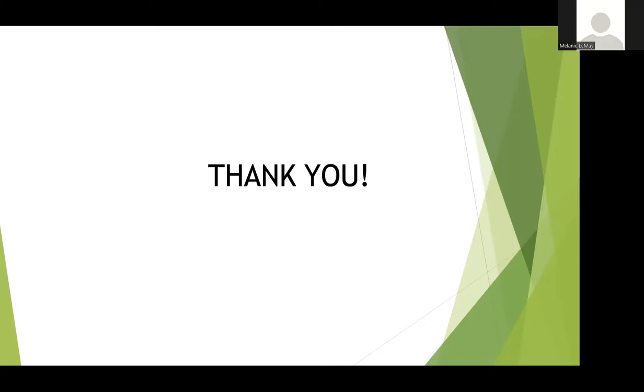Maybe just to add to that too, sorry, it's Melanie talking. Joey, that was a great presentation. And I just wanted to add that fluid responsiveness is not always the same as fluid appropriateness for the patient either. Just because they're fluid responsive doesn't always mean that we should be giving fluids. And that can also be another thing that people should stress: don't do it in isolation. Because if you look at that in isolation, you might say, yep, they're responding to fluids, let's go ahead, their blood pressure is low, and that might get them into more trouble. So fluid responsiveness definitely does not always equal appropriate for that patient.